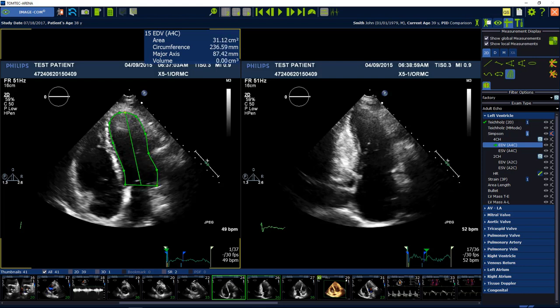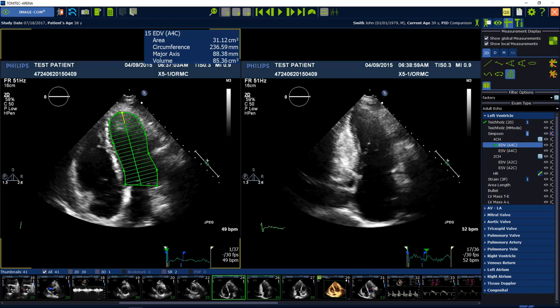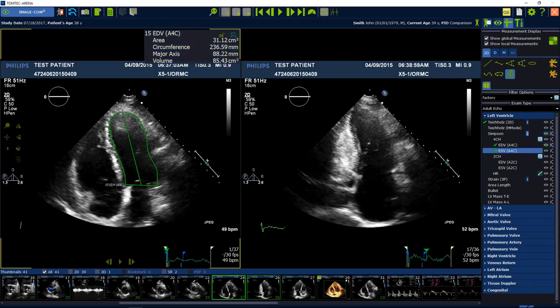Place your last dot at the opposite mitral annulus position with a double click in order to close the contour. Move your mouse to choose the proper position of the rotation axis.